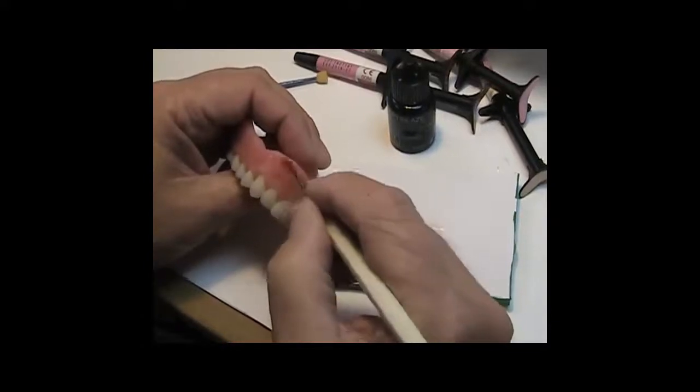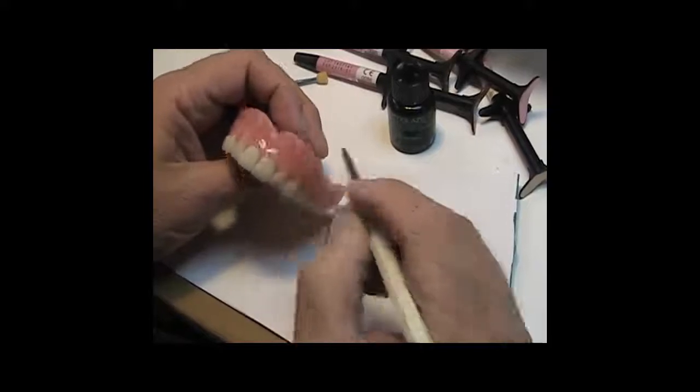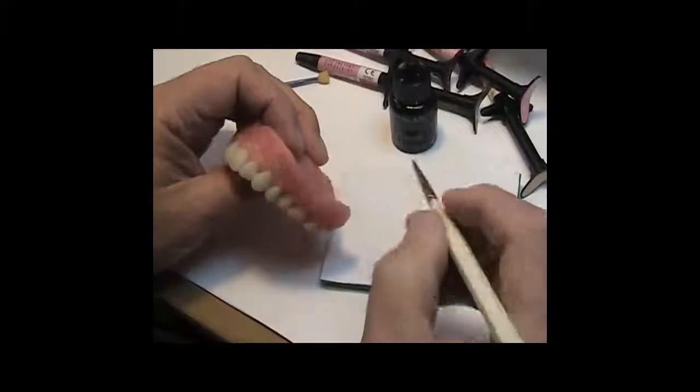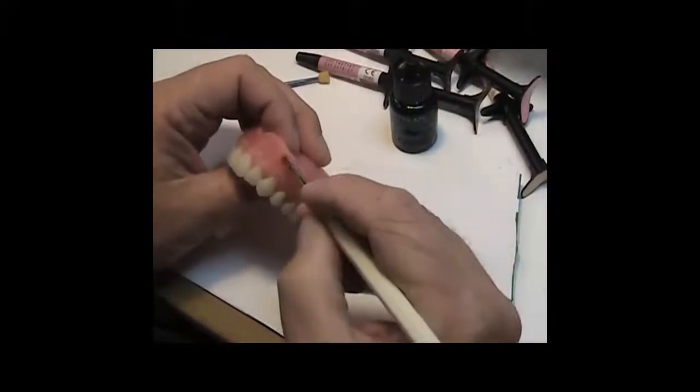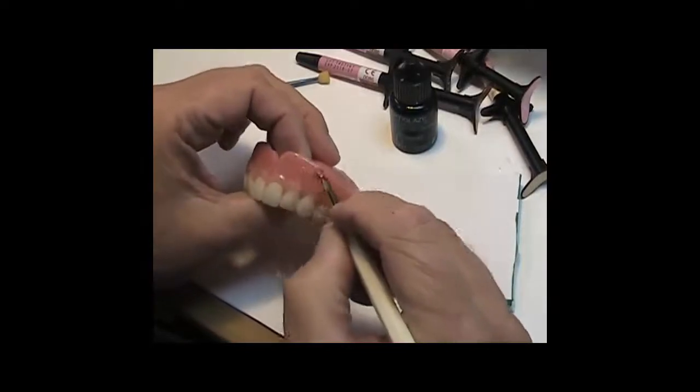What I want is a surface which is semi-glossy and non-attractant to biofilm. And so, what I do is I first put a light coat of the OptiGlaze Clear on the surface because I want to start a texturing process, as I mentioned.